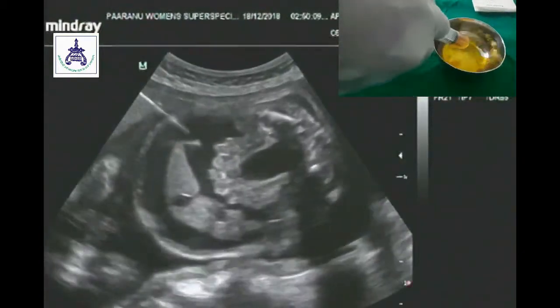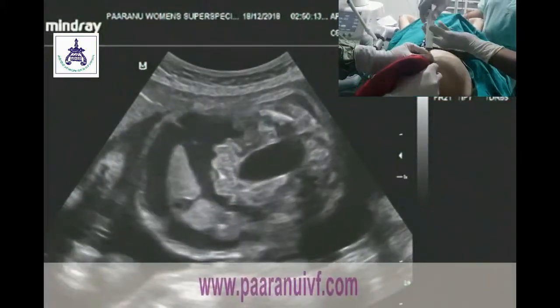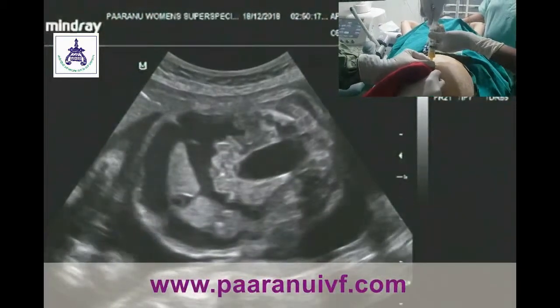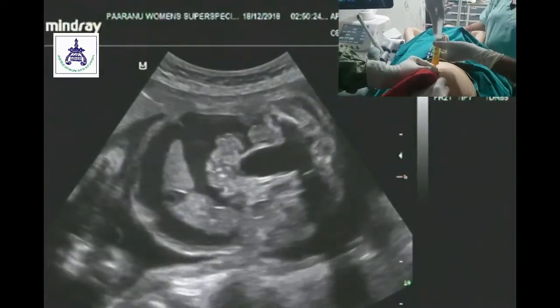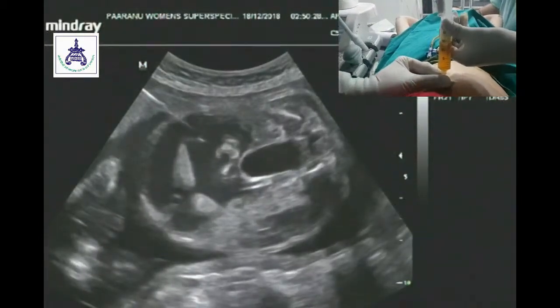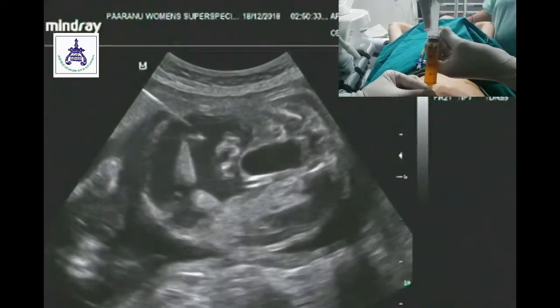Again we are attaching the syringe a second time to the needle, and again using negative suction we are aspirating the fluid from the fetal abdomen. With each aspiration, around 20 ml of fluid we are withdrawing from the fetal abdomen, and with that effect gradually the abdominal distension is coming down.